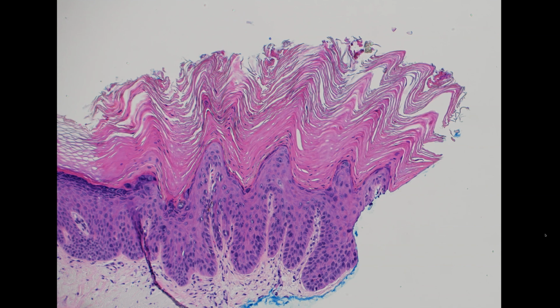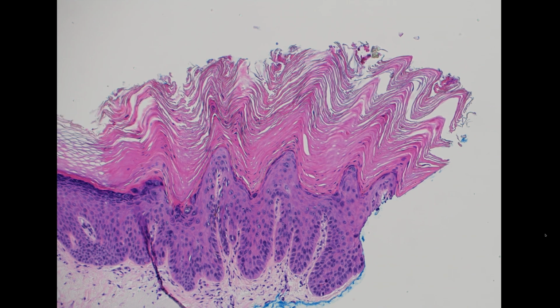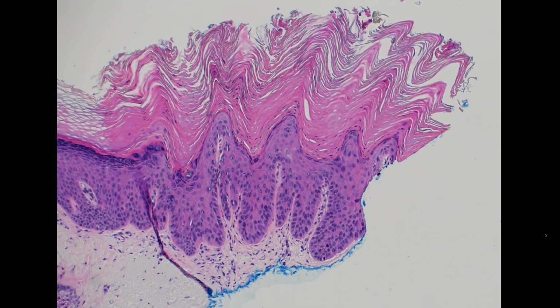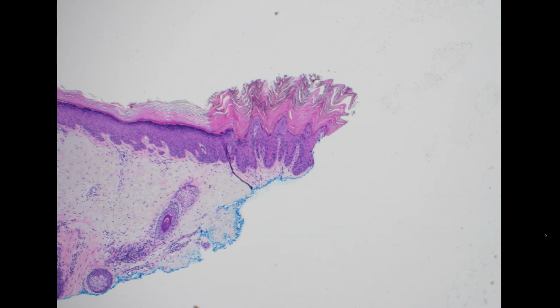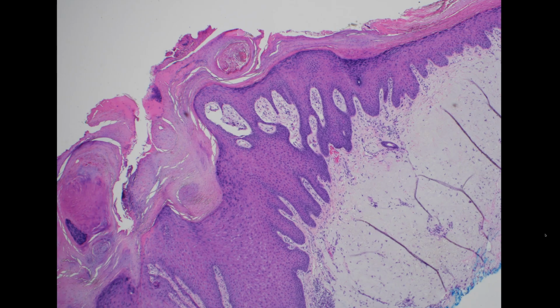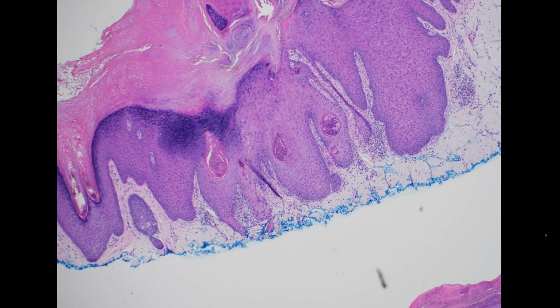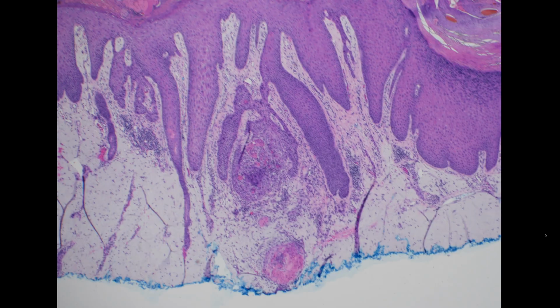So this is caused by chronic sun damage, and it's kind of a form of dysplasia or precancerous keratinocyte change, and a subset of actinic keratoses will progress into squamous cell carcinoma. And actually, this one probably is just incidental at the edge of a bigger biopsy, because over here we actually have a thick area that looks like actinic keratosis on the top, but down at the bottom is starting to invade into the underlying dermis.